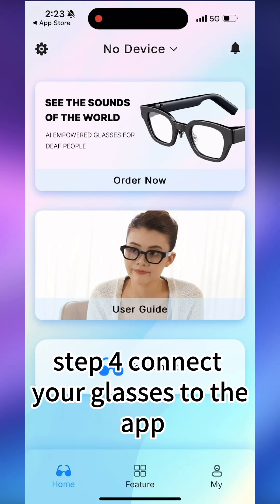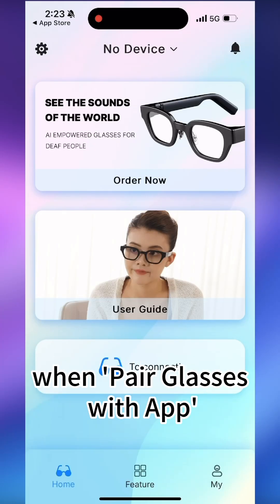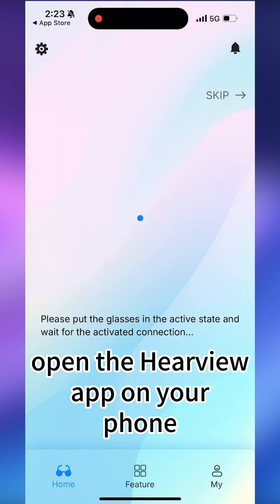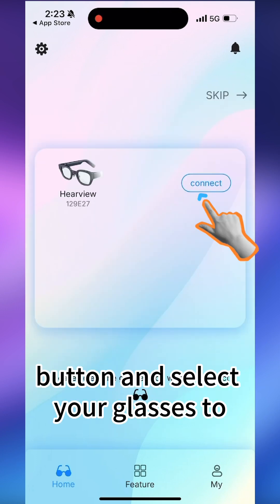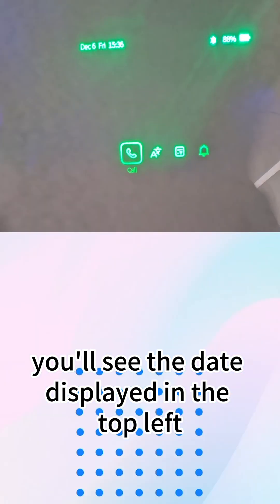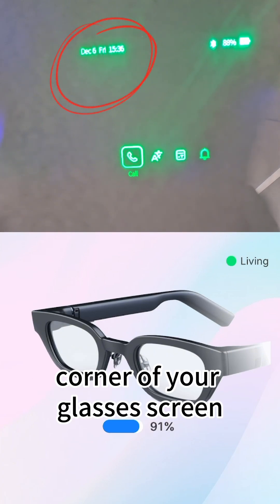Step 4: Connect your glasses to the app. When 'Pair glasses with app' appears on the glasses screen, open the HearView app on your phone. Tap the Connect button and select your glasses to establish the connection. Once connected, you'll see the date displayed in the top left corner of your glasses screen.